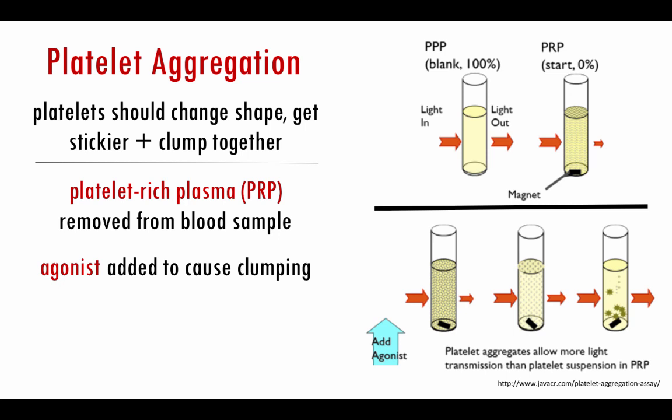And if they are functioning correctly, they will form pretty large visible clumps, and then what will be left behind is kind of a clearer plasma, right? So all those little things that were evenly distributed, all of a sudden it's not evenly distributed because they're forming big clumps and potentially just falling out of the solution. So they leave behind this kind of clear fluid.